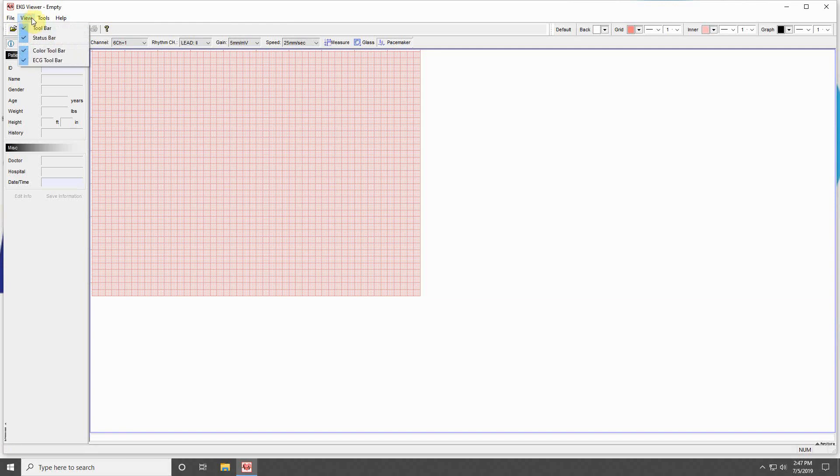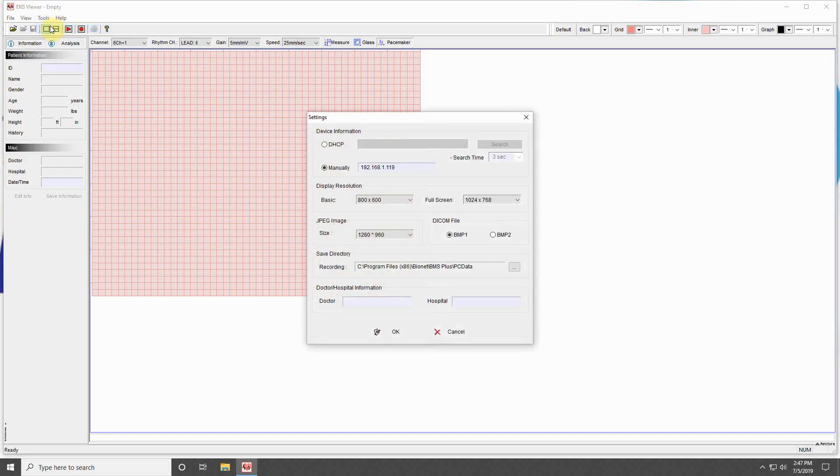Next is the Tools menu, where the Settings menu is located. The first setting should be familiar to you if you have connected a machine to the software, but this setting is where you will input the IP address for the device you would like to connect to the software.